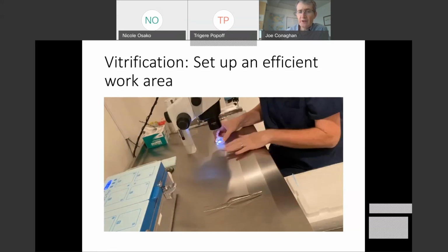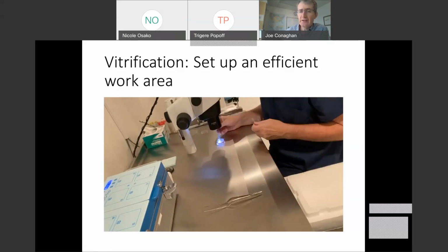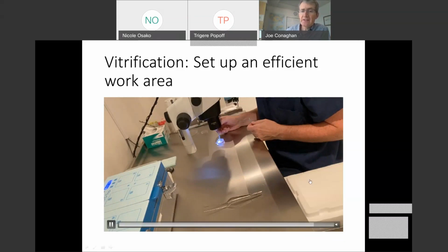So you get out your warm plate of media and you very quickly grab your cryolock and you pull off the cap of the cryolock and you get it into the warm media like instantly, right? So by having this little triangle right here, everything is within arm's reach, everything is really close. You can get your cryolock with your eggs or embryos on here out of the liquid nitrogen and into a dish that's at 37 degrees without any loss of temperature. And by doing that all very quickly and having a very efficient workspace, you're getting the maximum possible warming rate for whatever tissue that you have on that device. So set up your area to be efficient like this, have it nice and clean like this, and don't have it all cluttered with stuff in your way, and you will get the best warming rates that you can.